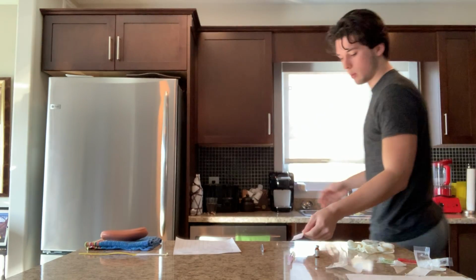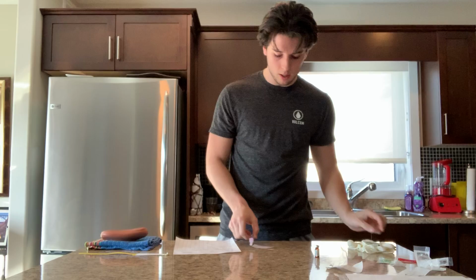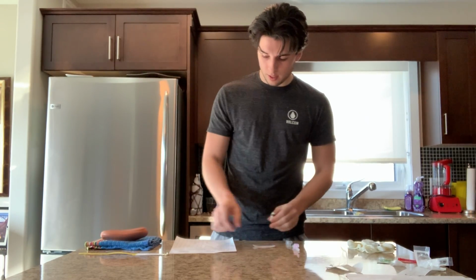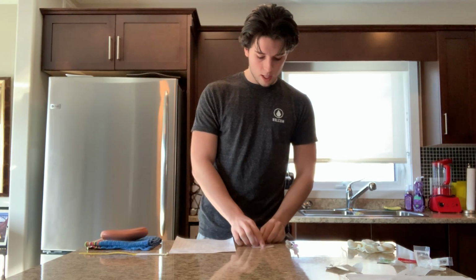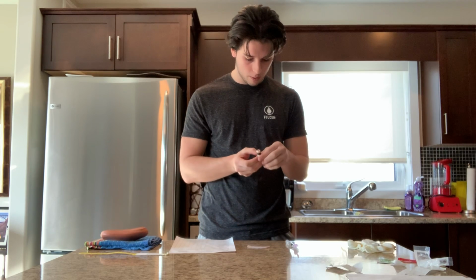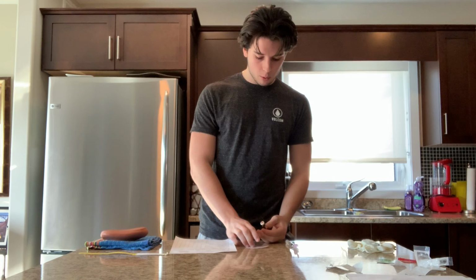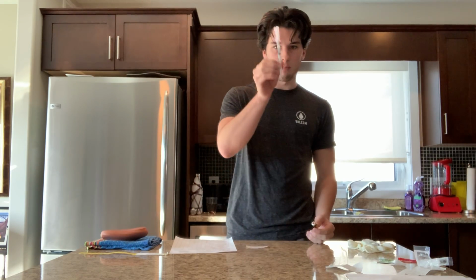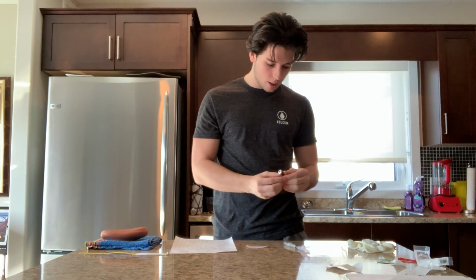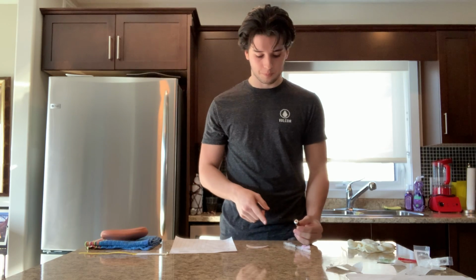So now that I have my label ready to go, I can move on and perform my second check. So I'm going to grab my MAR, my label, my syringe, as well as my vial, and start with my second check. I'm going to look at the name, Jake Nursing, JN for Jake Nursing. The drug is metoclopramide, and we can check here, it says metoclopramide. It is 5 milligrams, and 5 milligrams, which is 1 ml, so I make sure that I have my exact 1 ml in my syringe, which I do with no bubbles. And when I check my concentration here, it's 10 milligrams for 2 mLs, which is how we know we need 5 milligrams per ml.